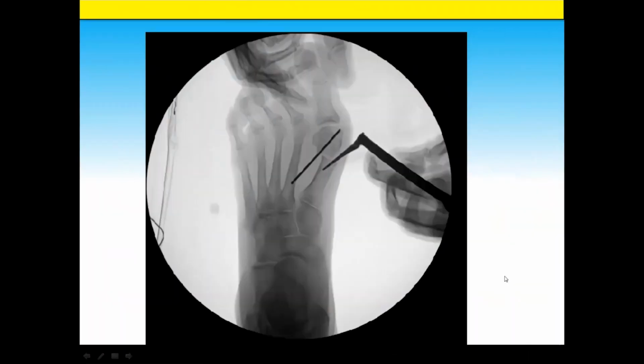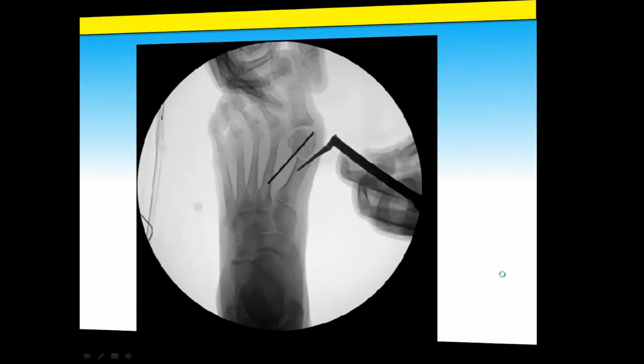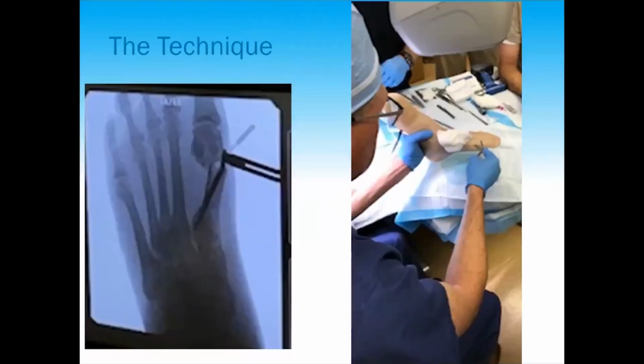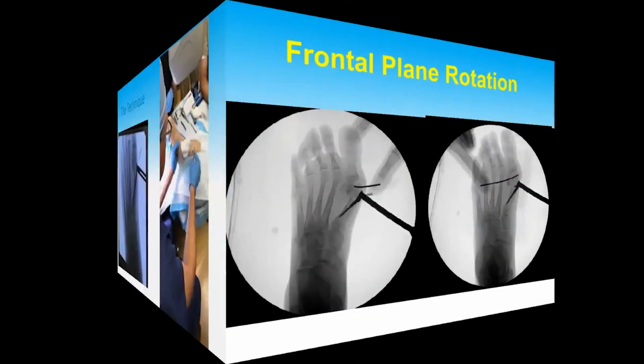Here's just an example of sliding in the implant. You can see checking and confirming on the AP X-ray that I'm in the canal, and then sliding it up the canal to the level of the neck of the implant, which is at the level of your osteotomy. Here you can see clinically how it looks. We're sliding it in and then pushing it in further.